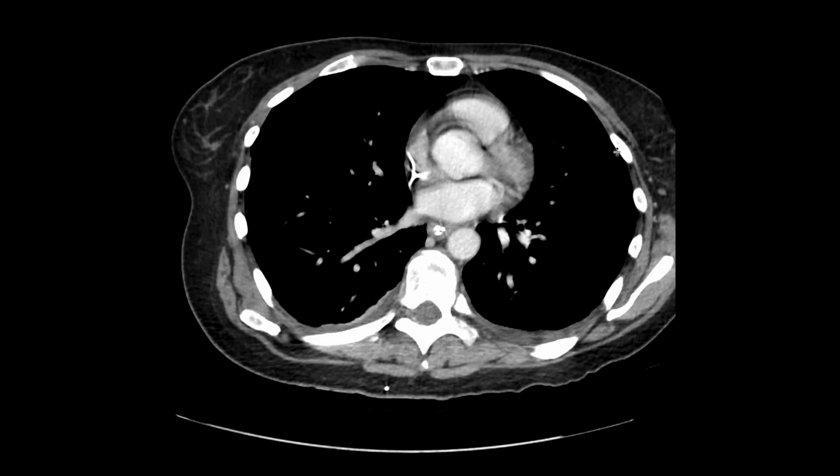Anyway, let's go through this case. This patient had stomach surgery. They had a distal antrectomy, so the more distal end of their stomach was resected, and then that was connected up to a piece of small bowel, the jejunum, so they had a gastrojejunostomy. All right, great. They're looking for a leak there.